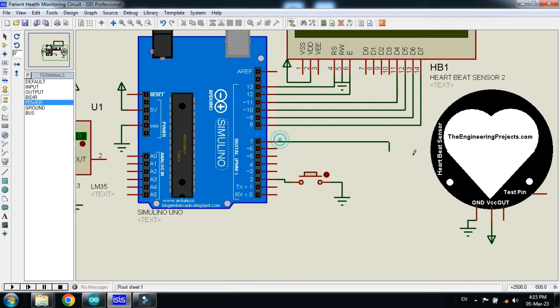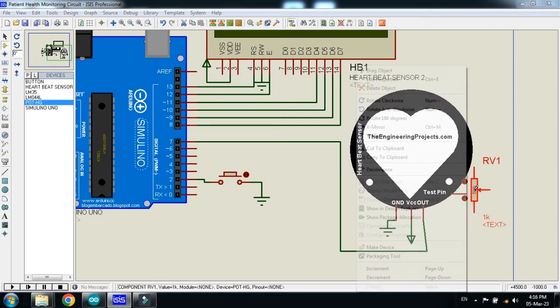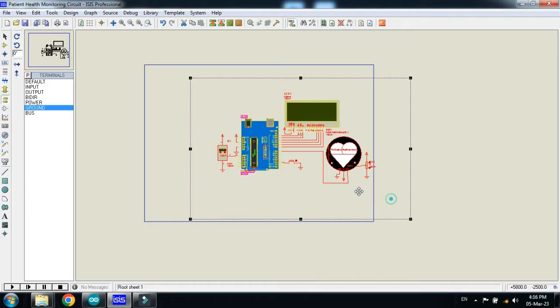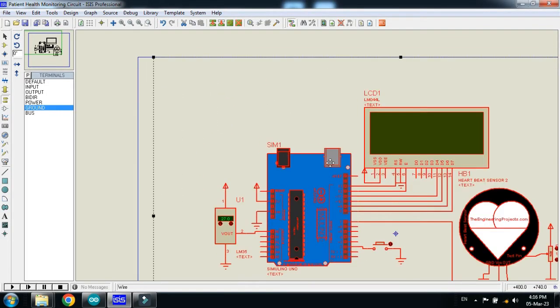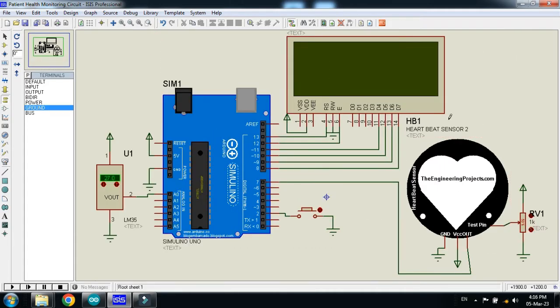Connect the pin of the sensor with pin 7 of the Arduino. Now connect the temperature sensor with the analog pin of the Arduino. Also connect the potentiometer with the heartbeat sensor. Connect power and ground with this sensor as well.